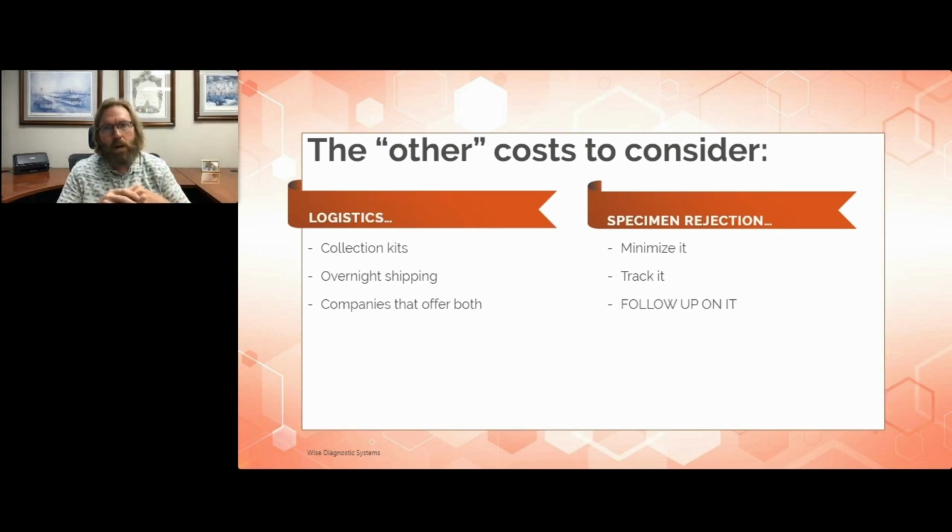One of the items, I'll give you an anecdote on this, is we had a lot of issues with the swabs either not staying in the tube or not being in the tube when we received them, or we'd go to open the tube and they would spring out. It was because the tube was slightly smaller than the break point on the swab.